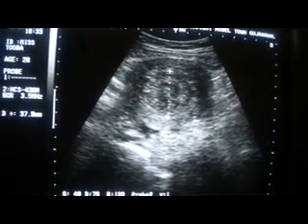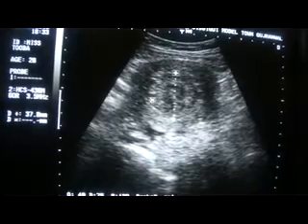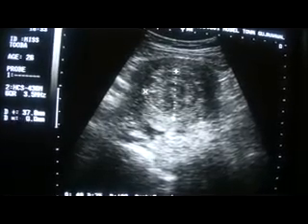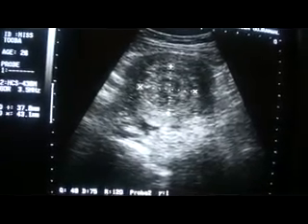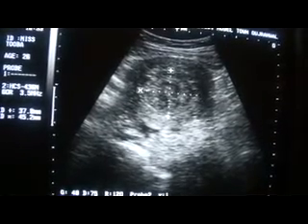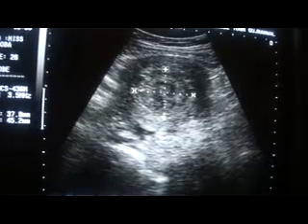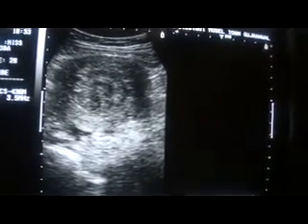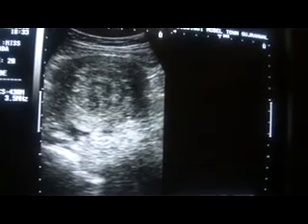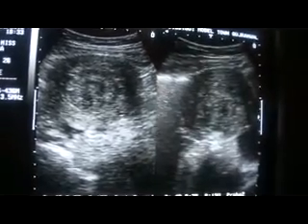Okay, now after going through the measurements, you can see that there is a significant amount of fluid collection in the pelvic cavity. This is fluid. And this is the urinary bladder. This black area that you are seeing is the urinary bladder in longitudinal section.